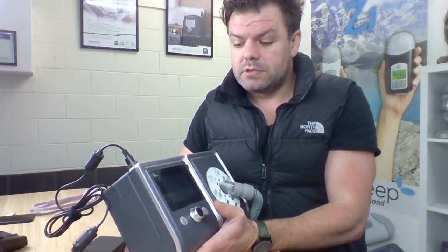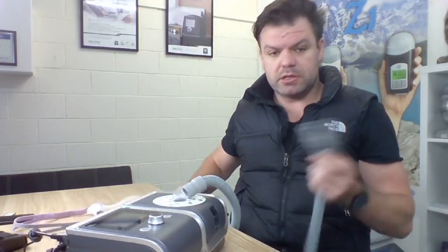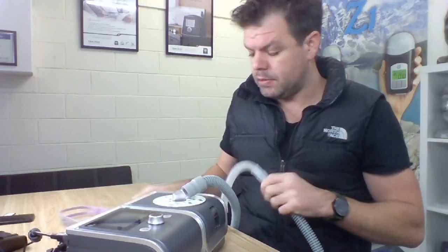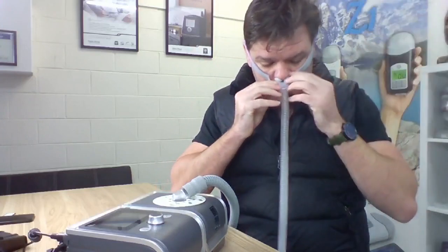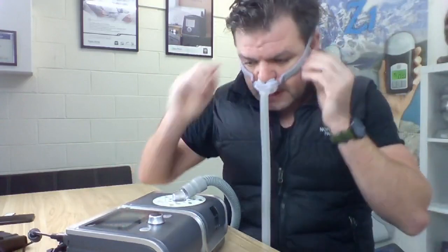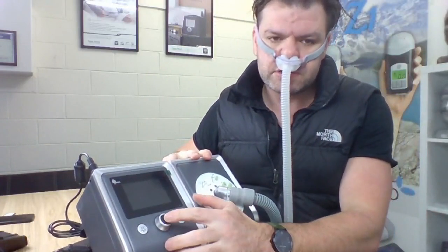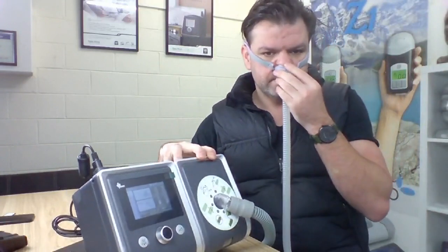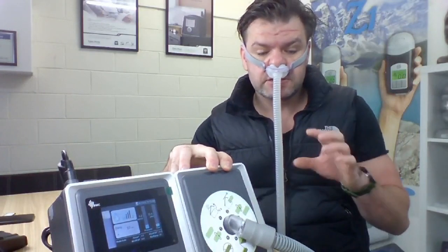Once we've filled up the chamber with water, we're pretty much ready to go. All we've got to do is grab our CPAP mask and connect it to the other end of the tubing. Then put the mask on like that. This is a nasal pillow mask, which sits just at the nostrils. It's not the prettiest thing in the world, but all we do with this one is hit the middle button. It does have an auto on feature which you can turn on, but just to turn it on today, I've just hit the middle button, and it's starting. So that's on and working now.